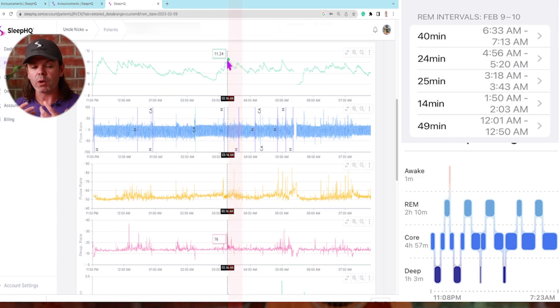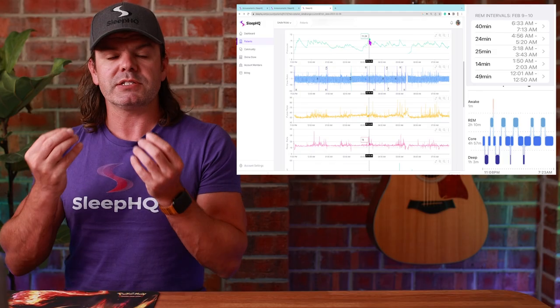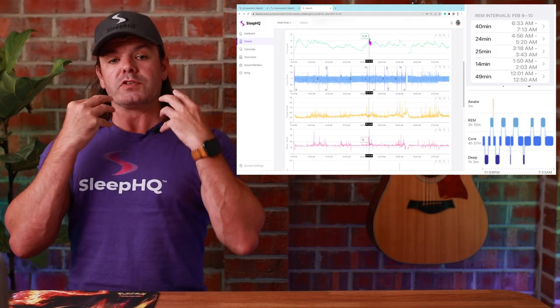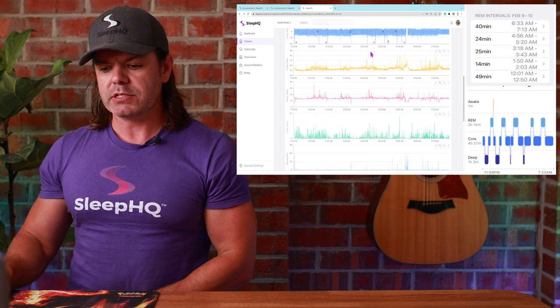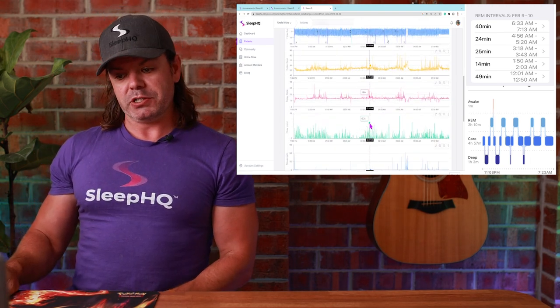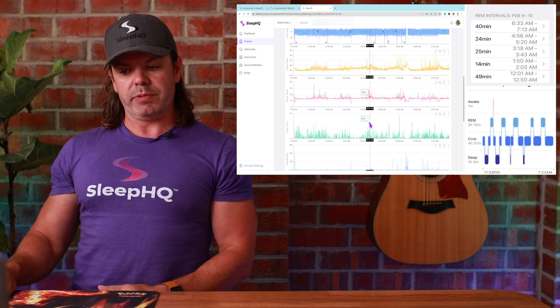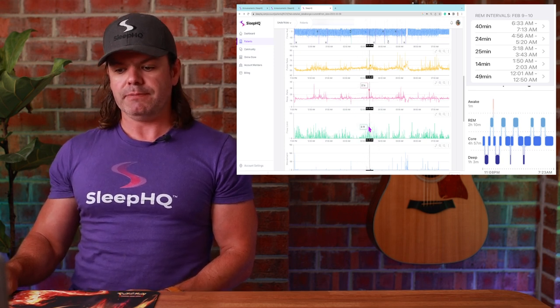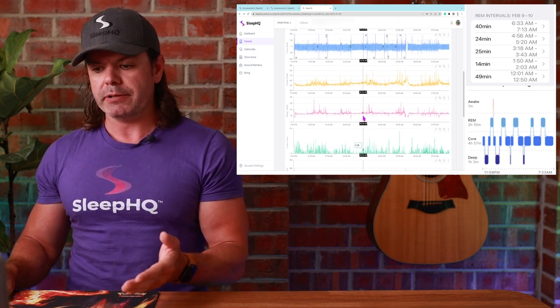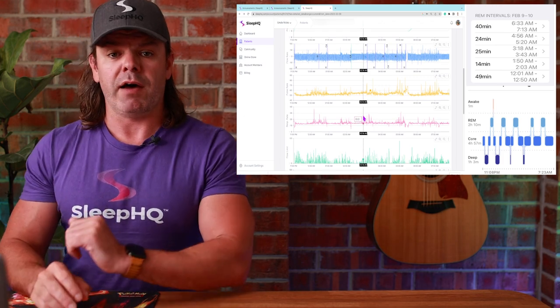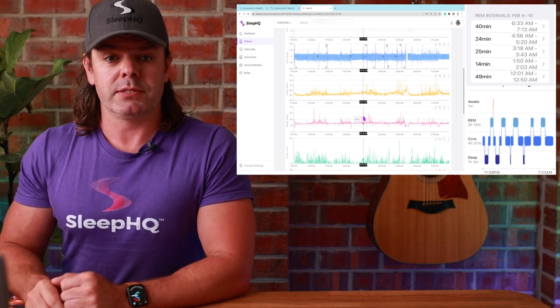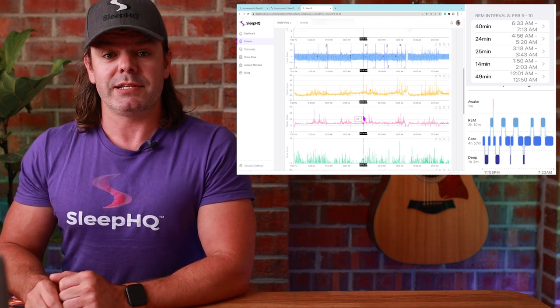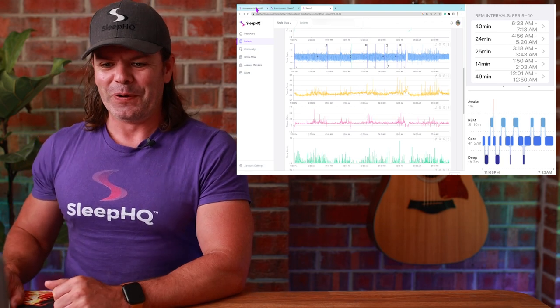Because the airway's collapsing, muscle tone's collapsing, jaws falling back, tongue's falling back, automatic pressure increases. And look at the flow limitation as well. Big increase in the flow limitation. This big cluster here, associated with that REM period. Now, there was a few members that laughed at me when I said this. I hate to say, but I told you so.